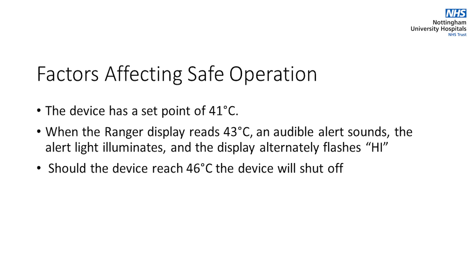The device has a set point of 41 degrees centigrade. When the Ranger display reads 43 degrees, an audible alert sounds, the alert light illuminates and the display alternatively flashes HI. Should the device reach 46 degrees, the device will shut off.